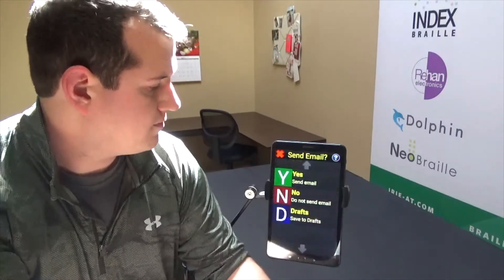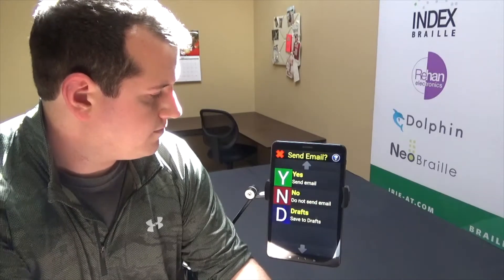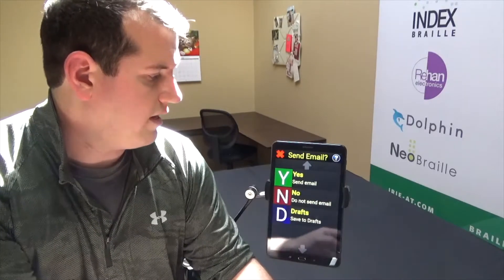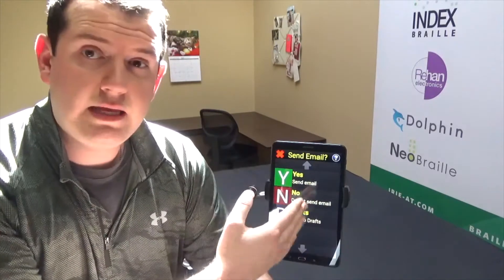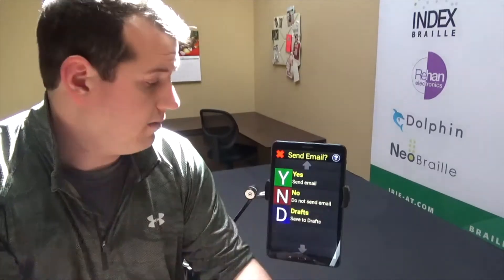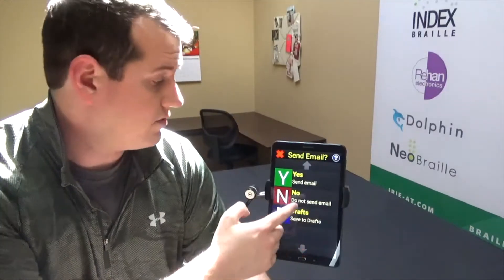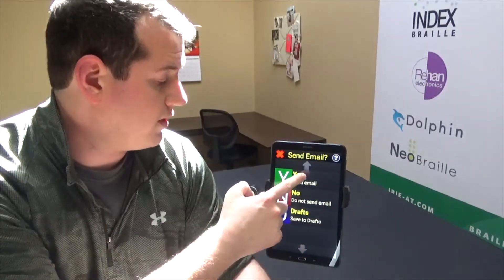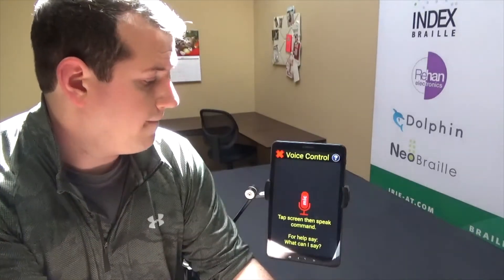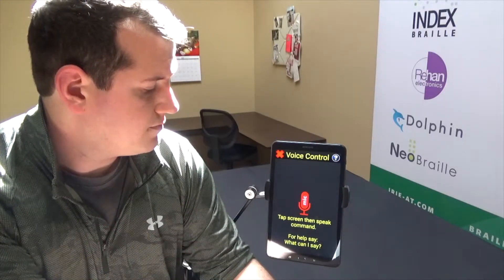I say 'send email.' The device responds: 'select yes, no, or more drafts.' So I have the option to send the email by saying yes, say no if I don't want to send it, or I can also save it to my drafts if I'd like. I'm going to say yes to send.